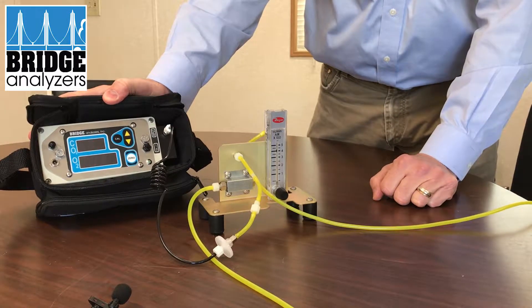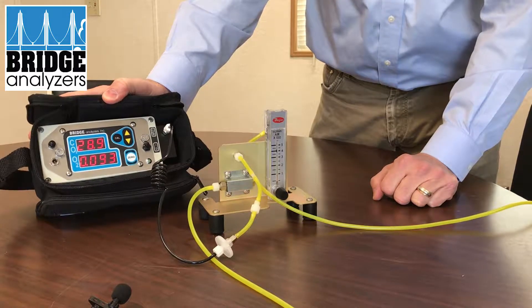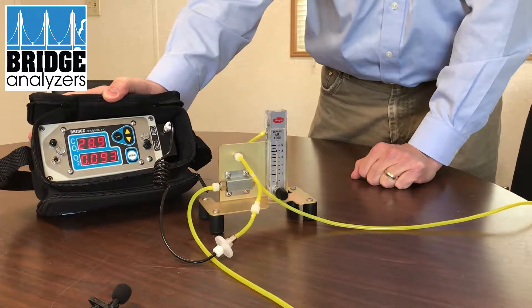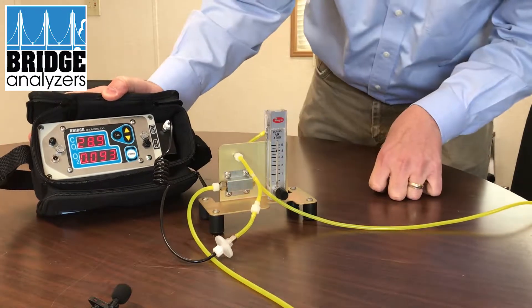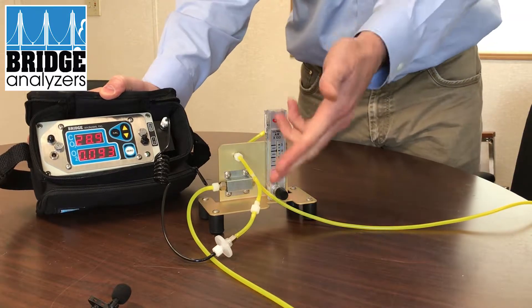What we have here is 30% CO2 balanced nitrogen. On the first test we're getting 29% CO2 and about 0.1% oxygen. So I can go back to the line and say I know we've got an analyzer that's reading properly.